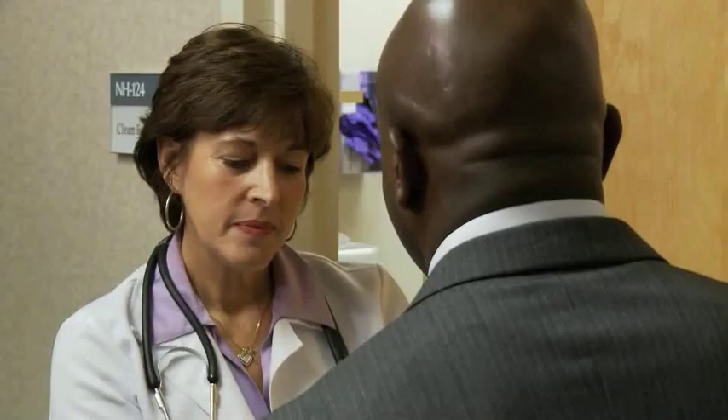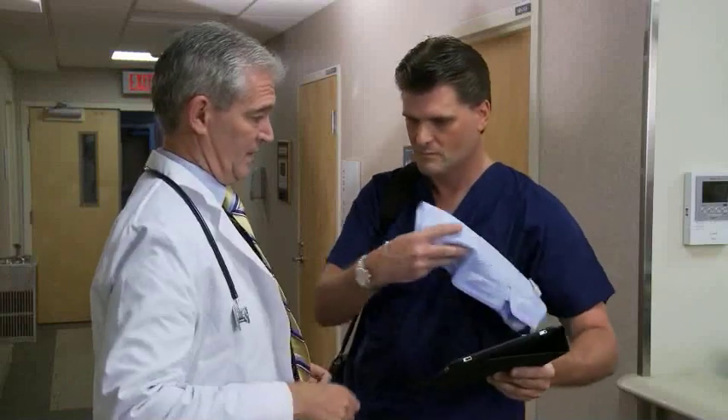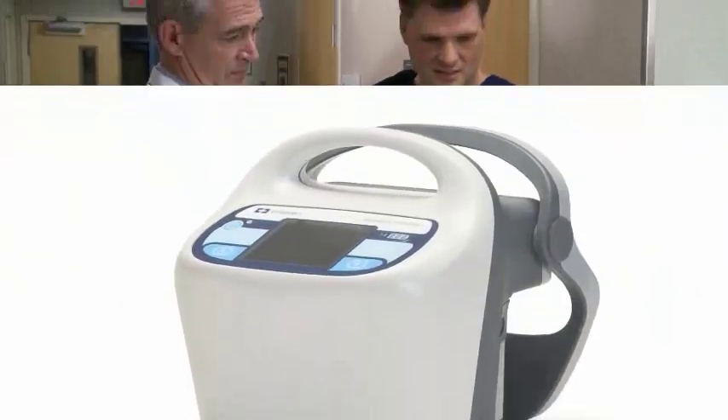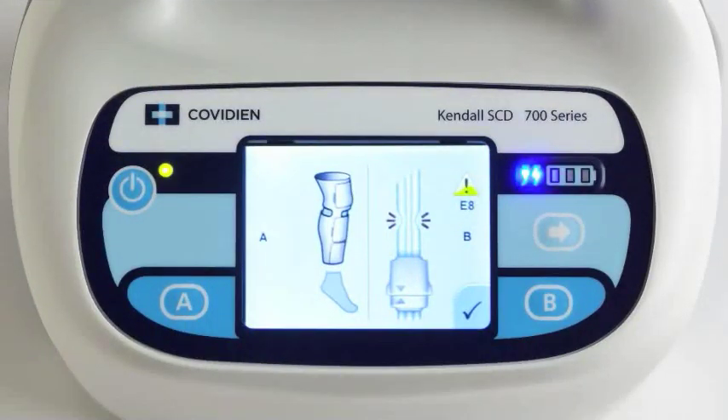Over the past 20 years, there have been many improvements in control and controller technology in the IPC market. Covidien is committed to providing products that are easy to use and provide mechanical solutions for DVT prophylaxis. Covidien's latest compression platform is called the Kendall SCD 700 series controller, which has a new graphical user interface designed to improve ease of use.